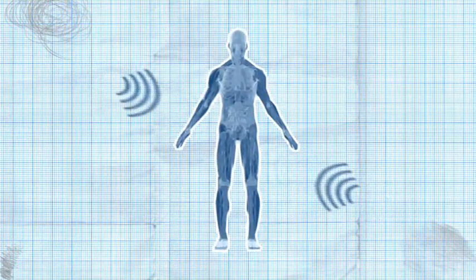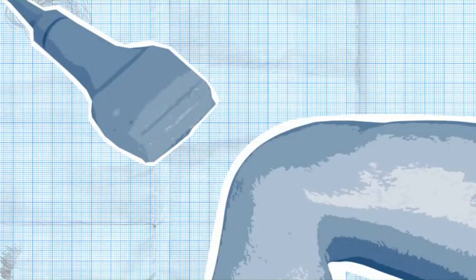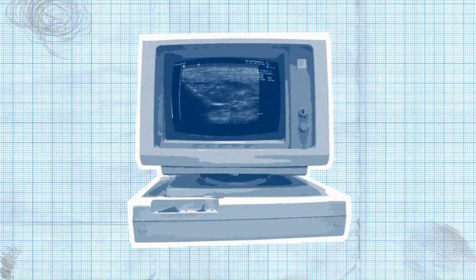Ultrasound waves are sent into the body. The useful thing about sound is that it reflects. So when the transducer sends sound waves into a knee, some of the sound is reflected and some absorbed, depending on whether it hits skin, muscle, water or bone. These echoes arrive back at the transducer at different times and are analysed by the computer and converted into a moving image.